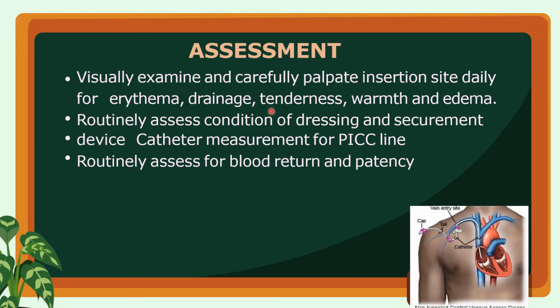To continue with your assessment, it is important to visually examine and carefully palpate the insertion site daily for erythema or redness, drainage, tenderness, warmth, and edema. And routinely assess the condition of the dressing and securement. It is also important to have a device catheter measurement for a PICC line, and routinely assess for blood return and patency. So this is very important.